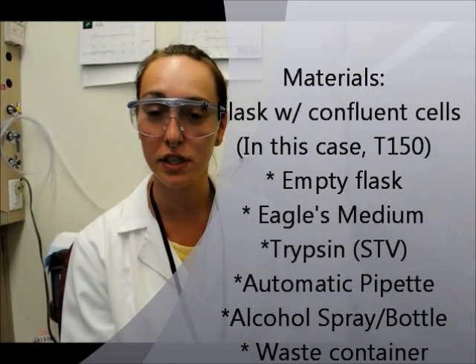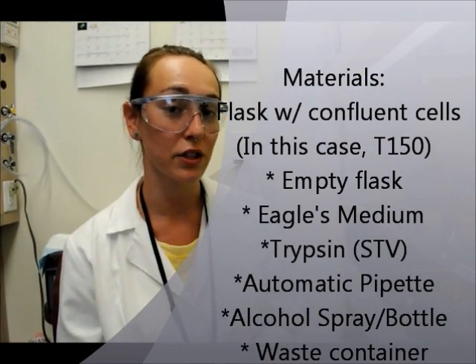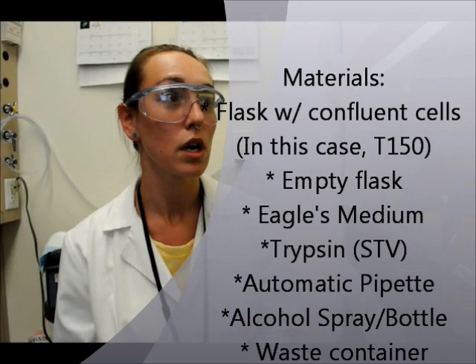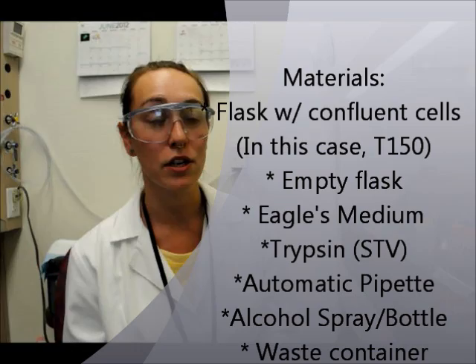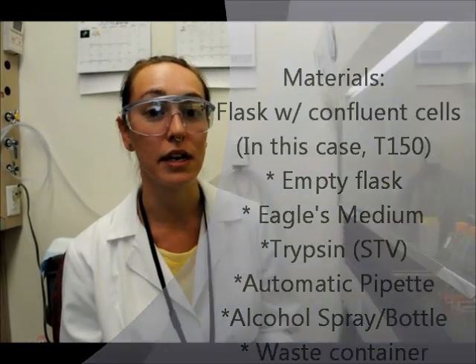You're going to need the flask with the cells you're going to split, a new flask you're going to put your cells into, eagles medium, trypsin, a waste container, automated pipette, and an alcohol spray bottle to sanitize everything.